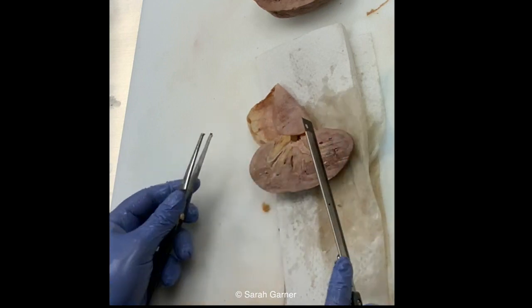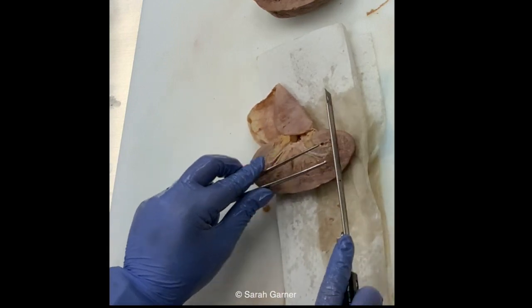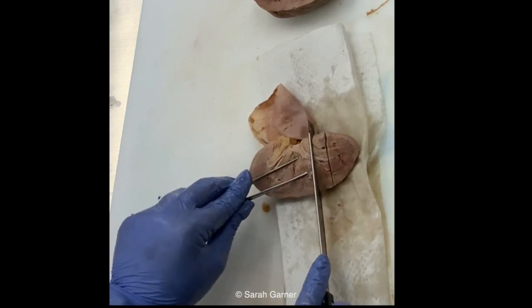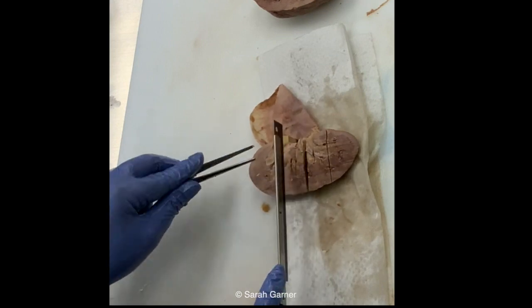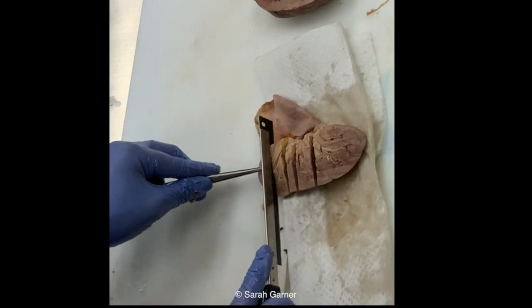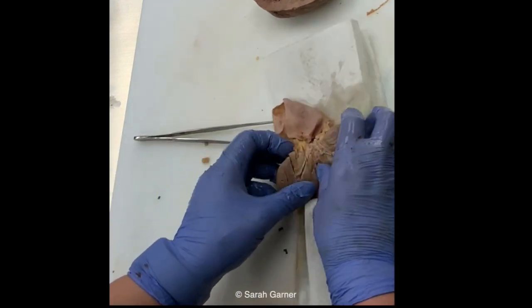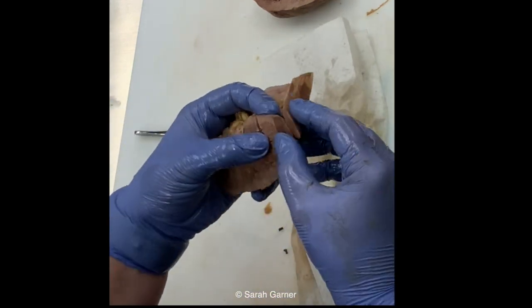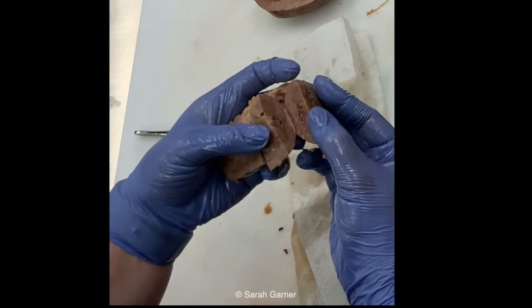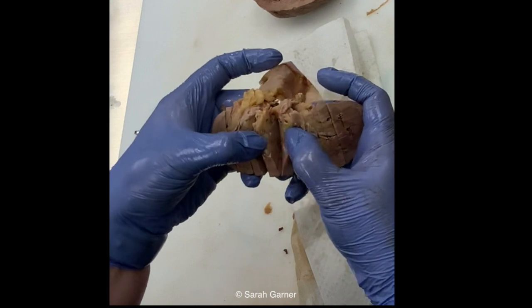So at this point, you then are going to have to section through your kidney to inspect fully. So with this, you should serially section. Okay, so I'm gonna make nice cuts. Basically, I just go either superior to inferior, inferior to superior, whatever. The point is just to get as much surface area as you can so that you can inspect it, okay? So now we can kind of flip through this and inspect each cut surface. And do we see anything abnormal? If so, we can note it, okay?